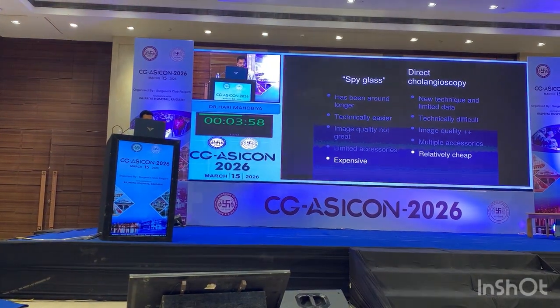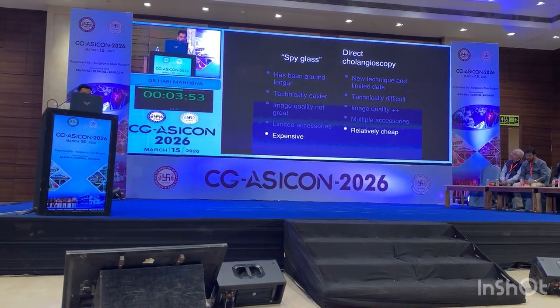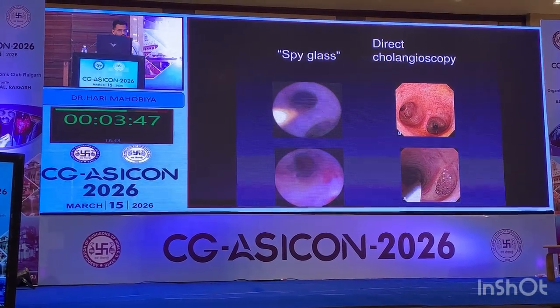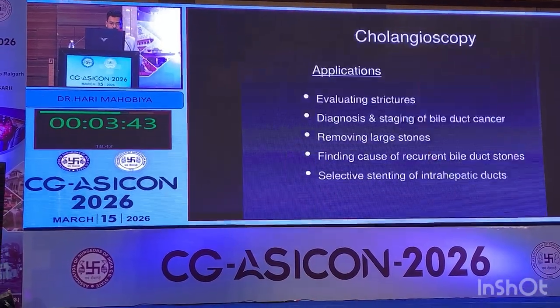Image quality is better. There are multiple accessories present and they are relatively cheap. And one more important thing is direct cholangioscopy. We have narrow band imaging with this, so we can see the view and the quality of the image. This is Spyglass. This is a cholangioscopy.